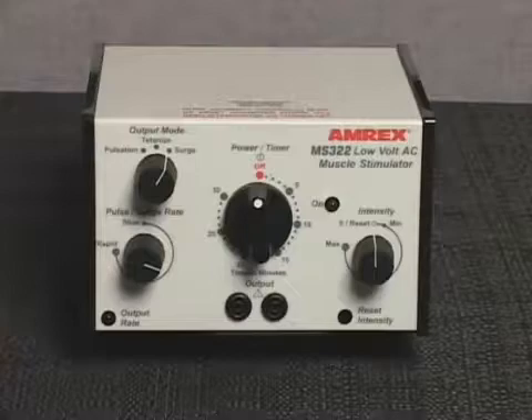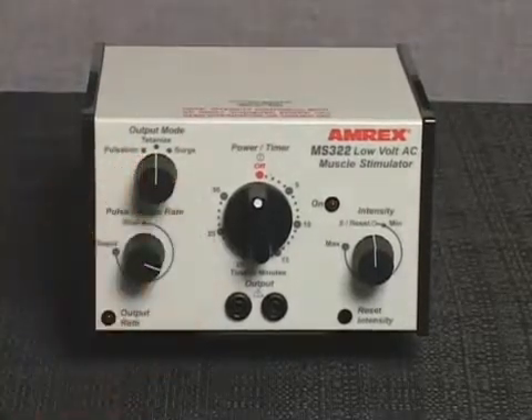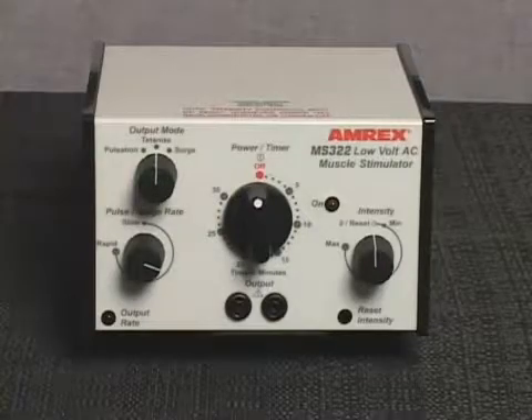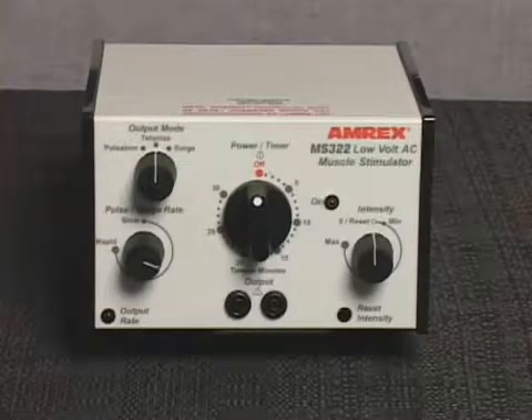The MS322 is equipped with an intensity reset circuit feature. This feature prevents the practitioner from applying one patient's intensity setting to another patient. Set the output mode control to tetanize. The intensity level should always be set while the device is in the tetanize mode — this will prevent unexpected surges of intensity.